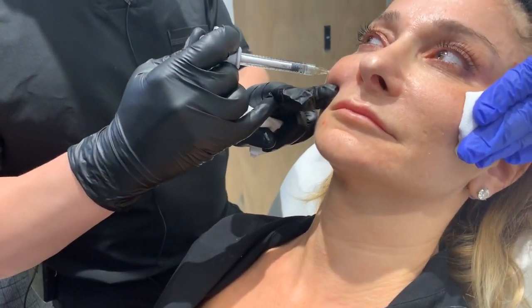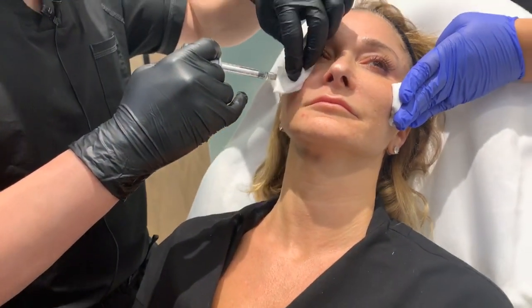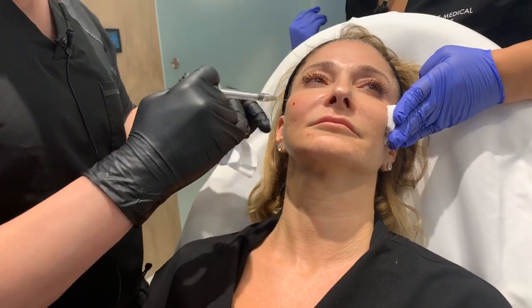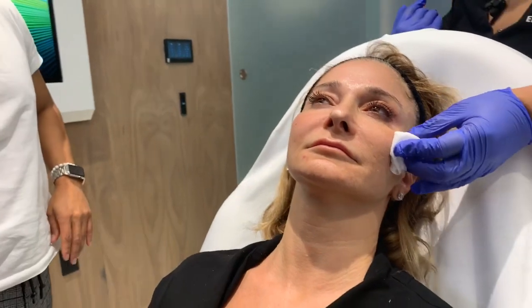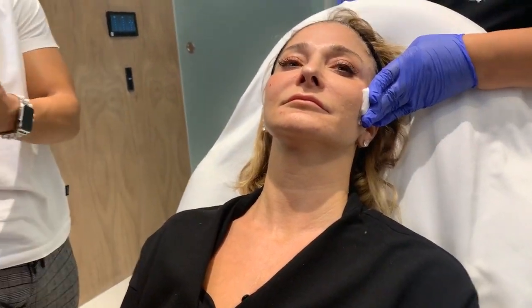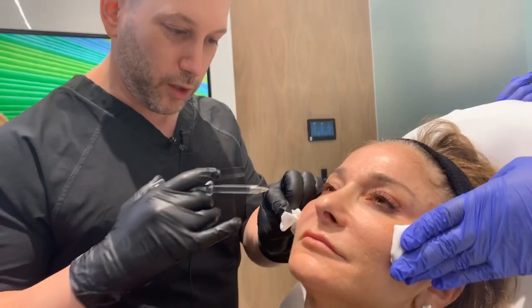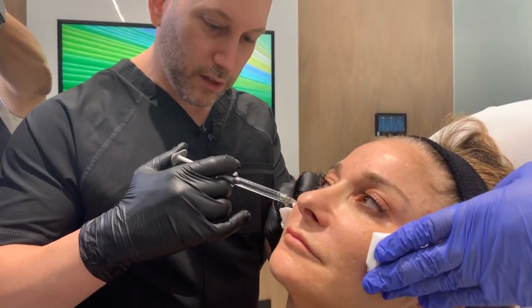Someone wants to know, what are you trying to achieve doing this? So we just said that I wanted to lift and contour the cheekbone. So that's what we're doing. We're using fillers to give her subtle lifting. What else can we use to get a subtle lift? Subtle lifting, we can do skin tightening, like Morpheus treatment. We can do Insta-Lift threads, or you could do a facelift.